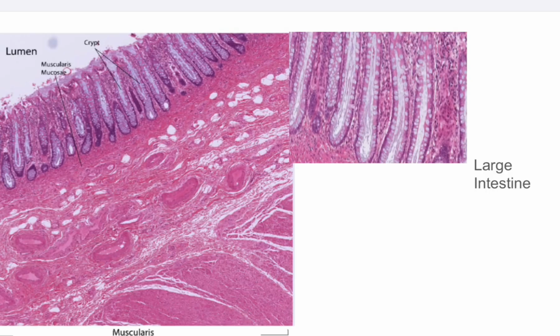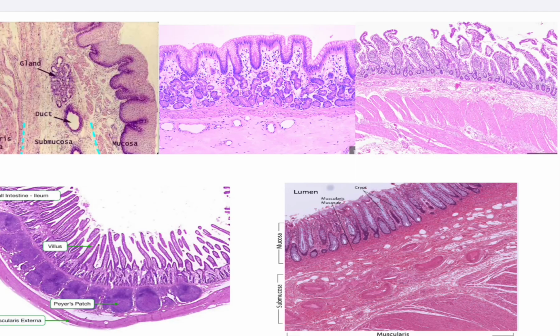So that is all about the different parts. Hope you have understood by this time the differentiating points between them. If you go through the pictures, compare them side by side, it will be easier for you. For example, here you can see the first picture.